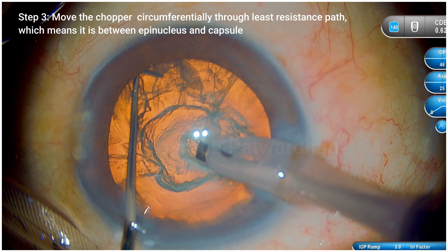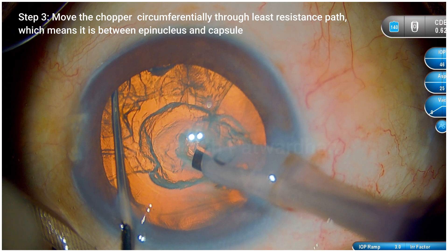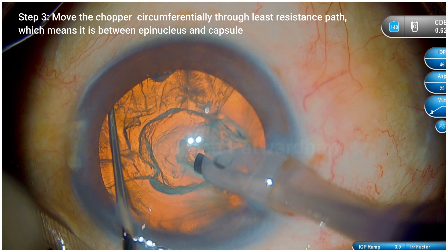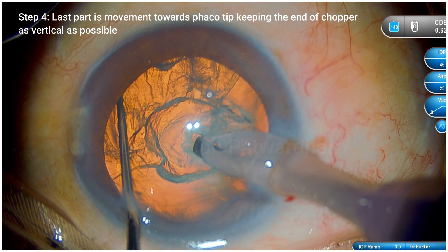If you feel resistance, that is not the right place. If you are going through the least resistant path, that means you are not entering the epinucleus but you are between the cortex and the capsule, which is good. And once you move it across, the chopper tip is right in front of your FECO tip.